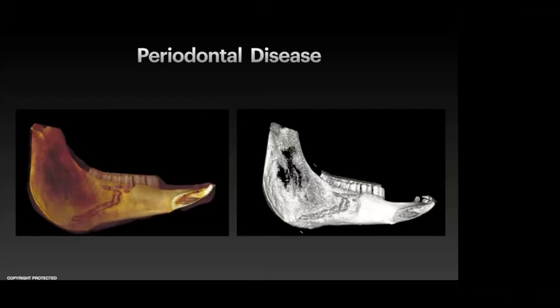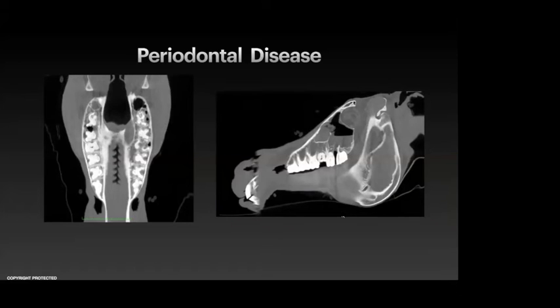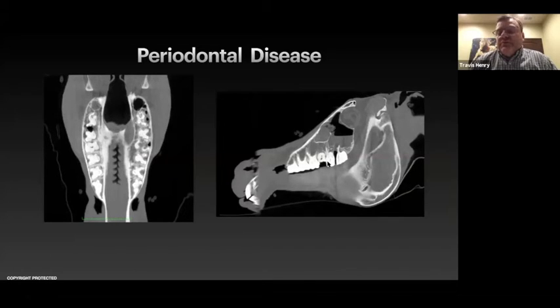I have one more, and then the rest we'll save for later. In the last case that you showed, if you would have extracted all these 3 molars, or at least 2 of them, how would you manage such a large defect to avoid an oral nasal sinus fistula? Well, to start with, the CT proved that we had a fistula already. So there you already have a hole, and these would be very problematic because when there's nothing in front of or behind where you're going to try to make a packing, it's difficult to keep it in there.